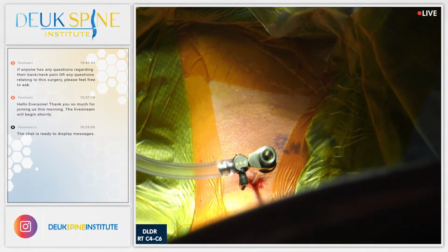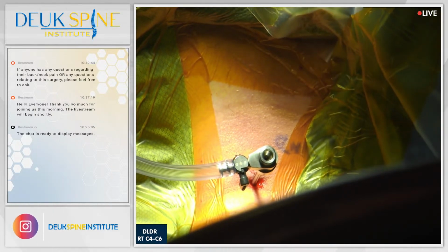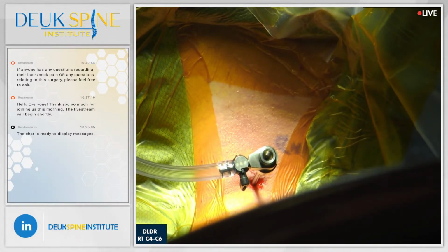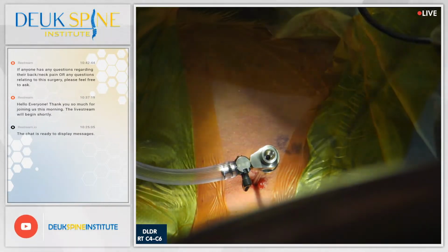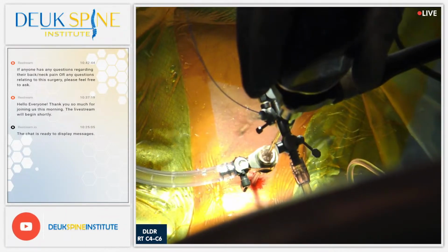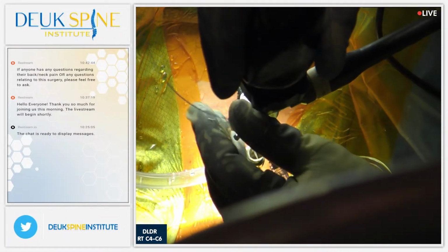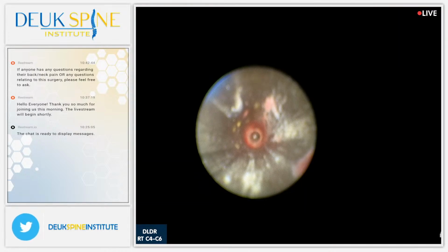The whole reason you need a fusion is because the surgeon took your disc out to get to the back. So this surgery eliminates the need for fusion, artificial disc, because we're not removing the patient's disc to do the surgery. We're just traveling to the back.